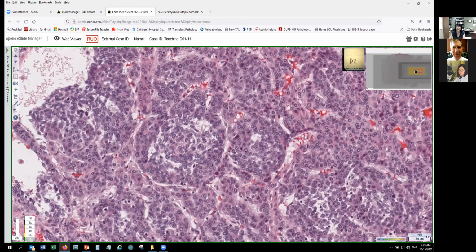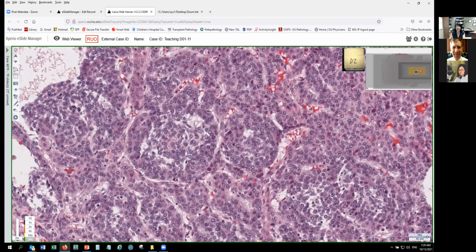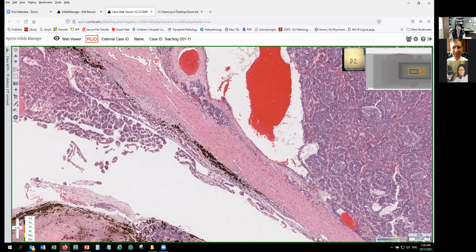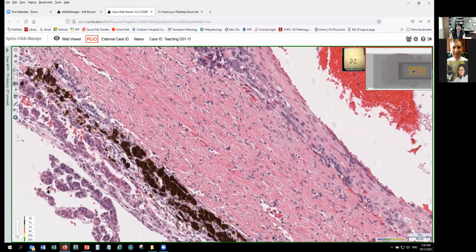This area I would consider embryonal type, with mitosis, cells more blue, N/C ratio higher. This is probably embryonal type. So there's a mix: this area is epithelial type with fetal and embryonal morphology patterns. This area has that melanin pigment.